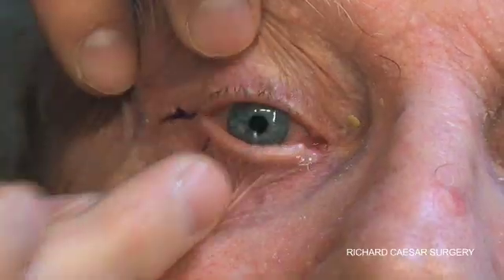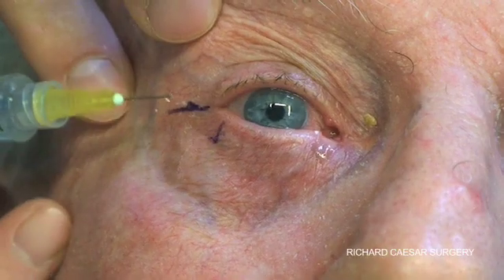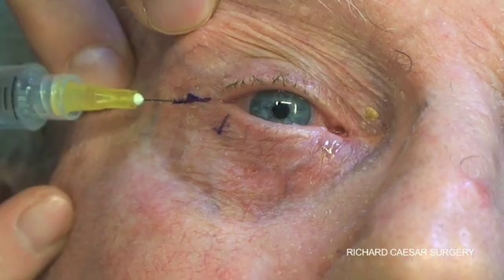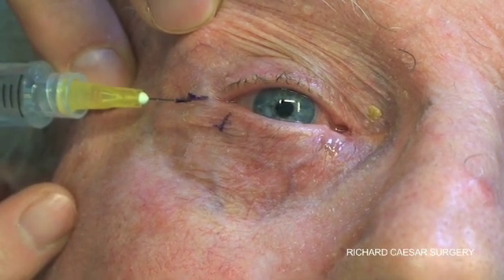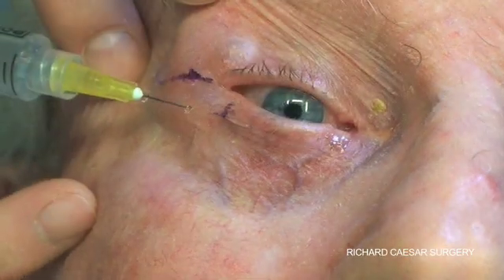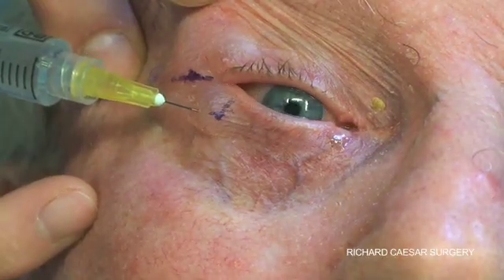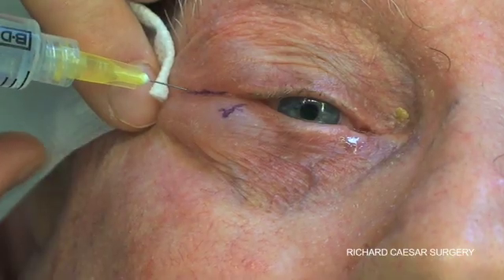This gentleman is also having a punctoplasty, but that's on a separate video. The local anaesthetic infiltration needs to be superficial and it needs to extend into the upper lid a little and along the lower lid a fair extent, and it's also useful to add some deep down carefully onto the orbital rim.